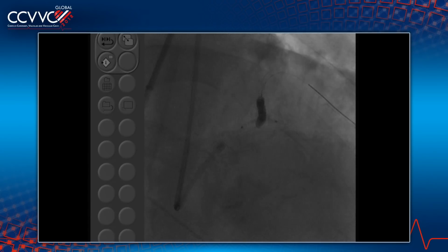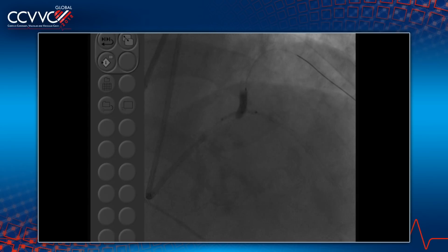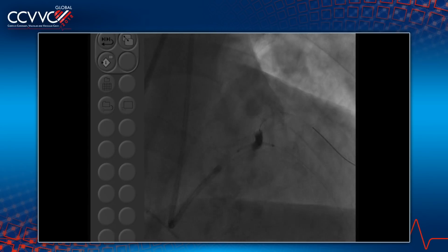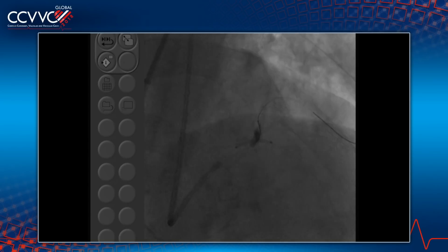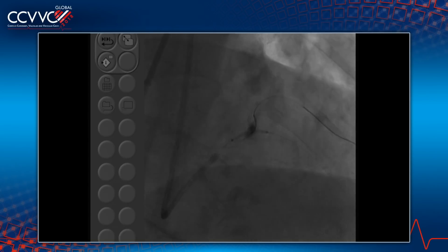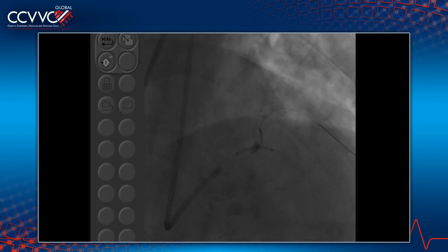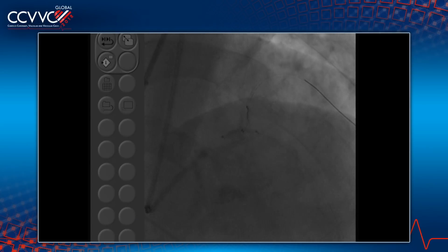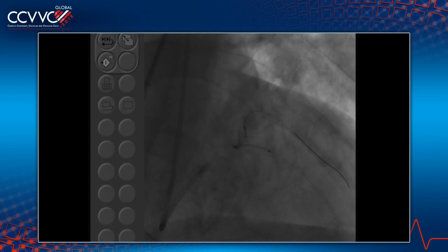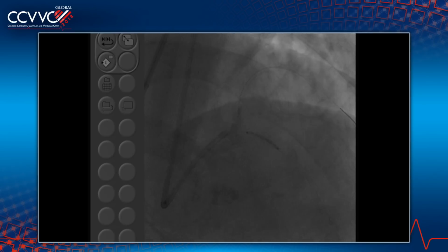So we are doing the left main, so the circumflex pre-dilation, which is a side branch. Okay, we are done there. Right now live, we see the stent, a stent in the circumflex. Then after that, you remove the side branch balloon as well as the wire. So the side branch balloon and the wire comes out.